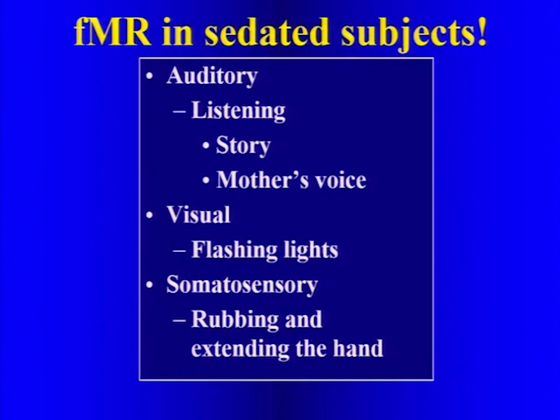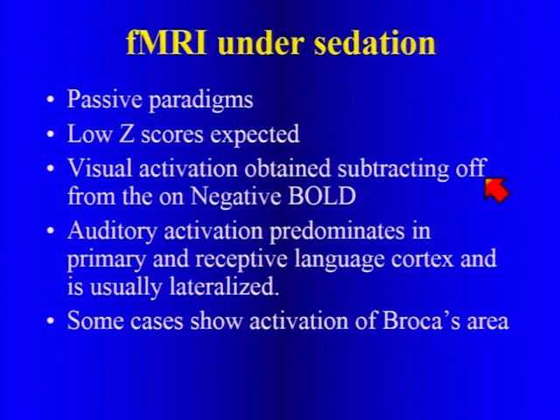So that's kind of our toolbox for children that are able to cooperate with us, although we've been doing sedated patients as well, and I just wanted to show you a little bit about that. Obviously, we have to do passive paradigms, and those consist of listening to the story in mother's voice, the flashing lights, and the somatosensory with rubbing and extending the hand.